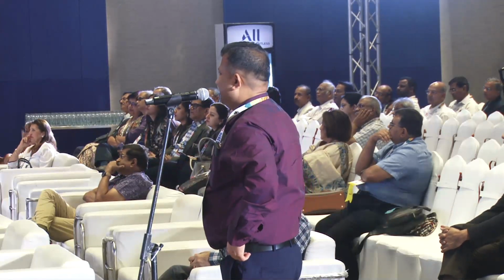He's wondering why the rent has occurred. So basically, you need a good ophthalmologist to check your vision, that you missed the rent at that time. No, I think sometimes there can be a capsulocortical adhesion that is taking it away, but you should be able to visualize it. It's just a question that when you have cleared up the entire cortex and the nucleus, that's the time the red glow comes out much better and you're able to visualize it. I don't know if you have to add.